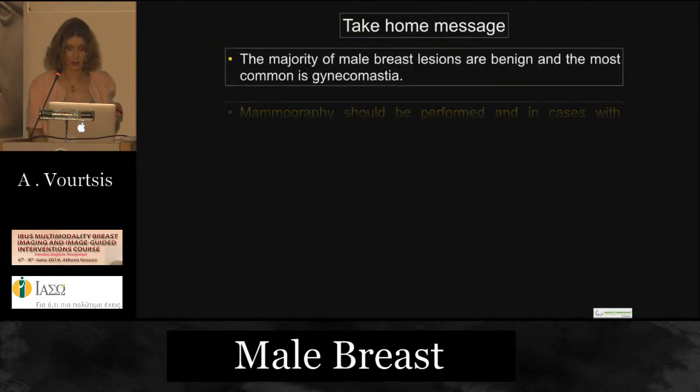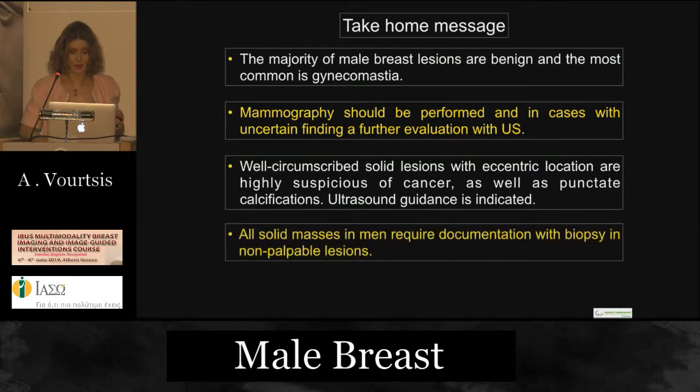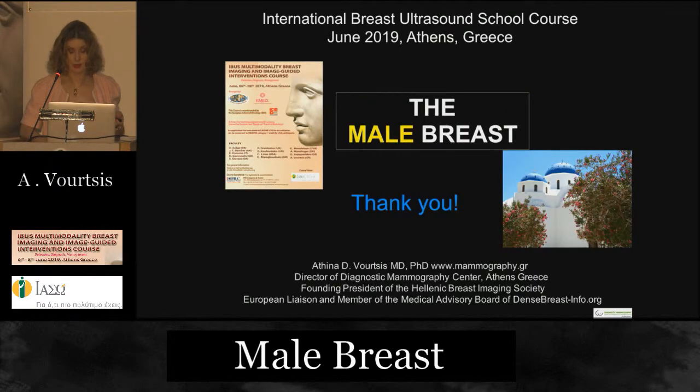So the take-home message is that, yes, indeed, the majority of male breast lesions are benign, and the most common is gynecomastia. We must be, however, familiarized with all these entities in order to be able to confidently differentiate between benign lesions and breast cancers, and ultrasound and mammography can be performed with high sensitivity, high specificity. Whenever you're not sure, please biopsy these lesions.